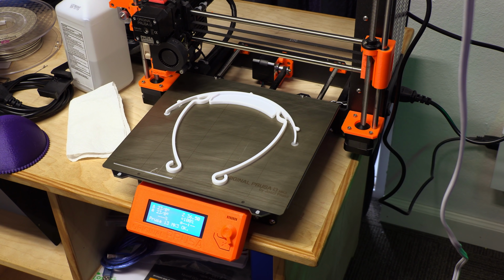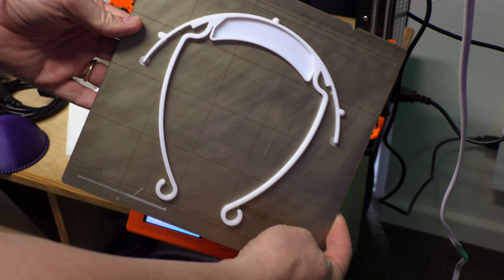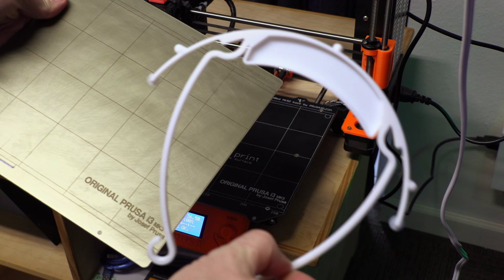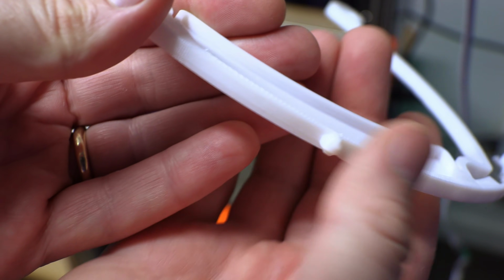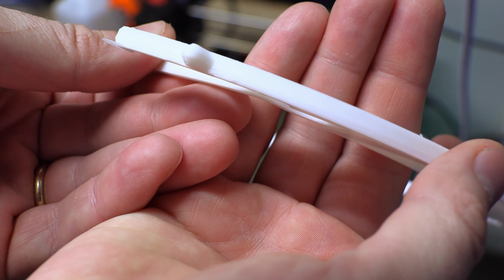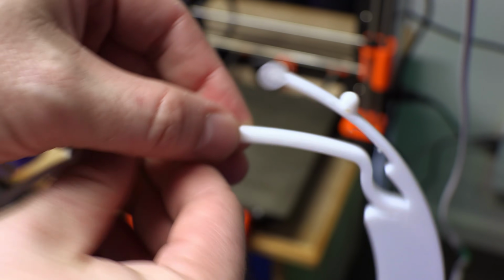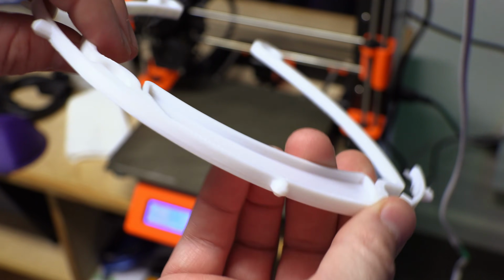Hours later. Looks like this Prusa's done. Let's get this off the build plate. It looks pretty good. And it's a flexible build plate, which means removing it is super easy. Let's get a closer look. This is a random spool of generic PLA I found, and it looks like the Prusa machine did a really good job with it. I'm impressed. The speed's going, so it looks pretty good. And there's the little mouse ears right there. Look at those things. They help keep that down. This is a good model.